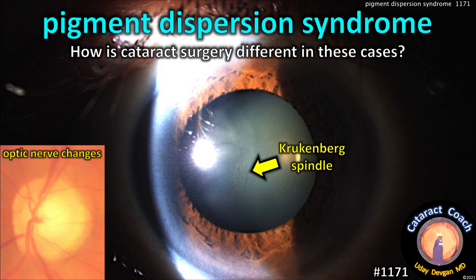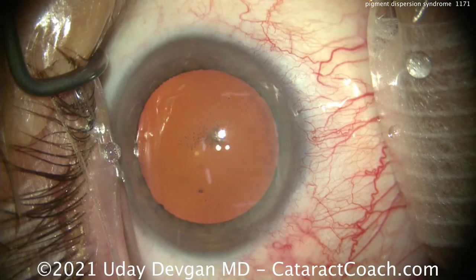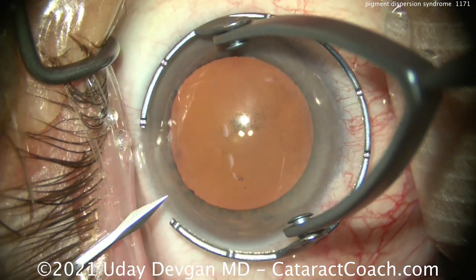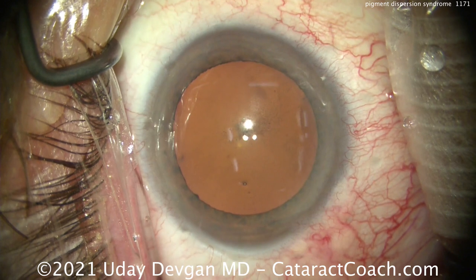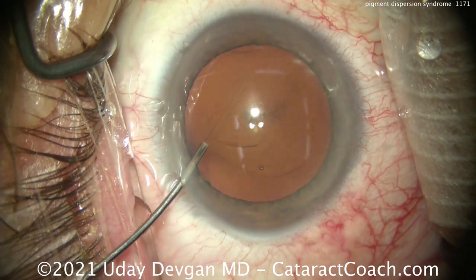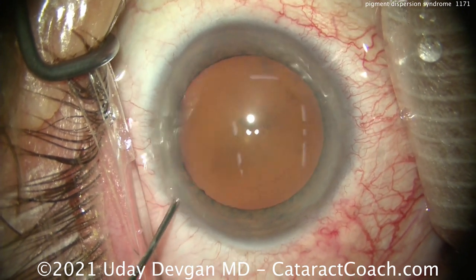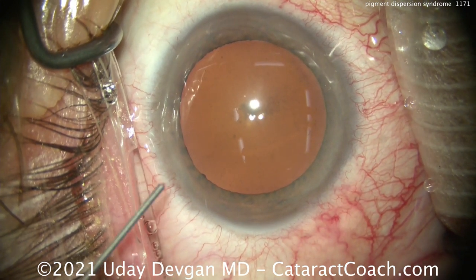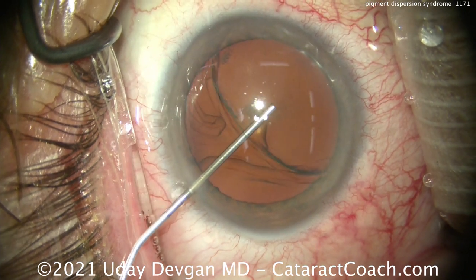CataractCoach.com presents Pigment Dispersion Syndrome — how is cataract surgery different in these cases? This patient has some optic nerve changes and a Krukenberg spindle. There in the center we can see slight opacities on the cornea — that's the Krukenberg spindle, which is basically pigment that's been dispersed in the aqueous. Because of the patterns of flow, it gets deposited right there in the center of the cornea.